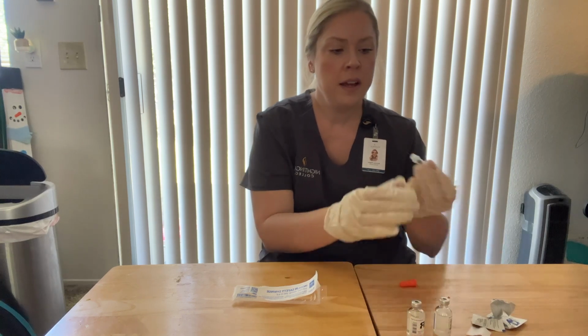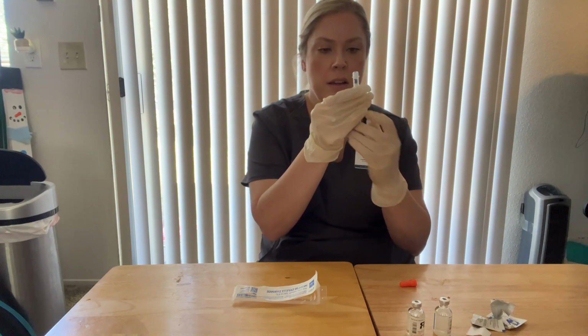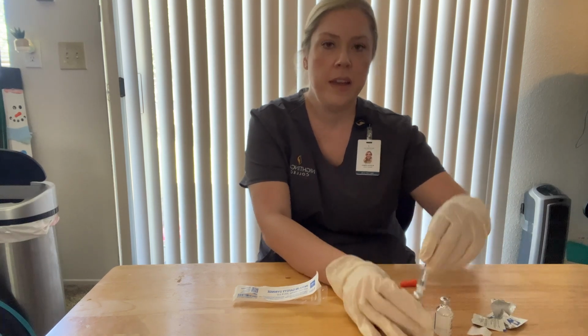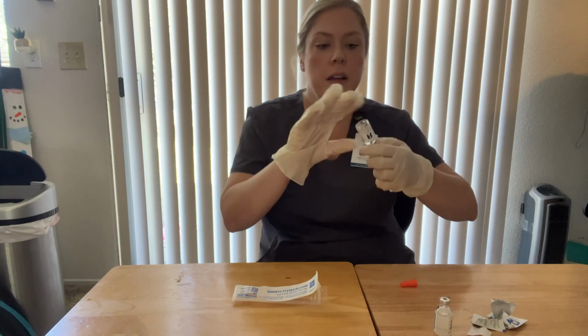Okay. I would then draw up 4 units of air and put that into the regular insulin. Withdraw. And this time I would want to actually withdraw that 4 units of regular insulin. Okay.